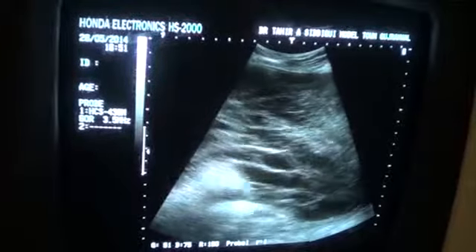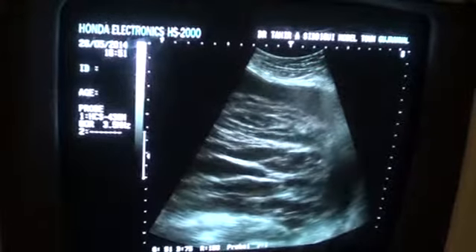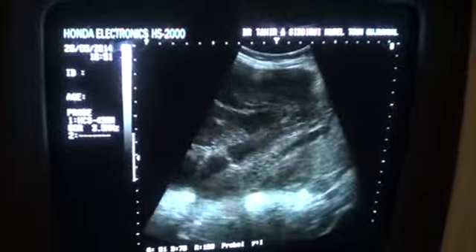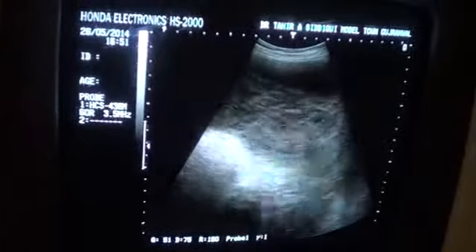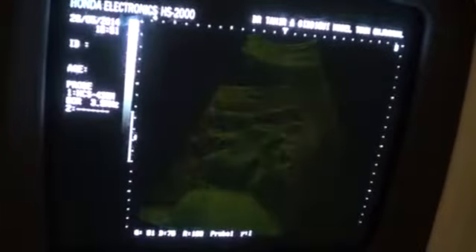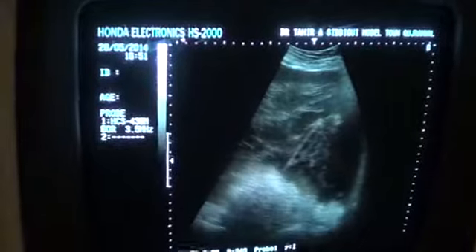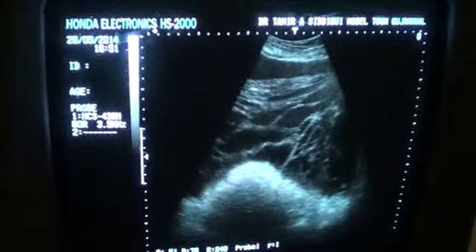They have been going from one doctor to the other, and she has been prescribed a lot of antibiotics, etc. When this had grown enough to make her abdomen protuberant, she visited the LHV, who sent this case. Now the placenta is at the posterior level of this whole issue.